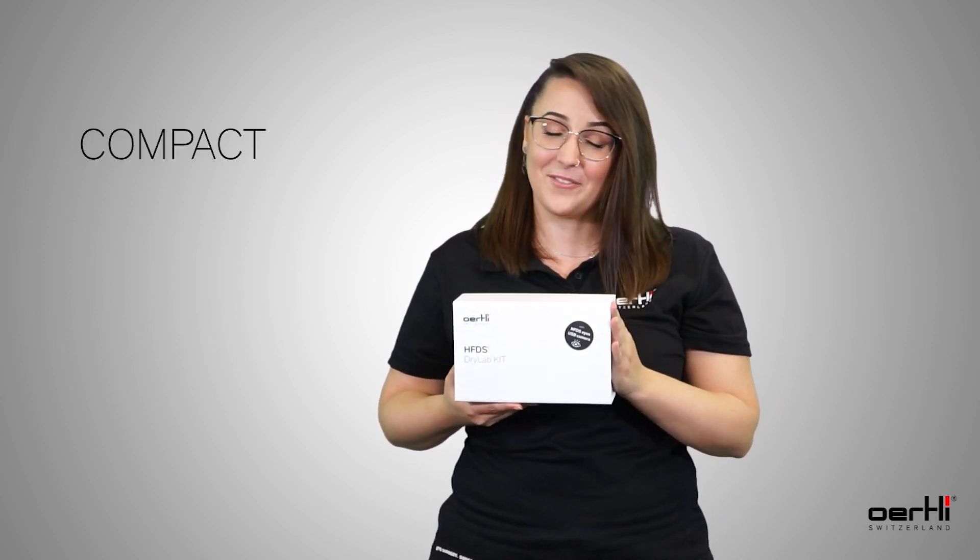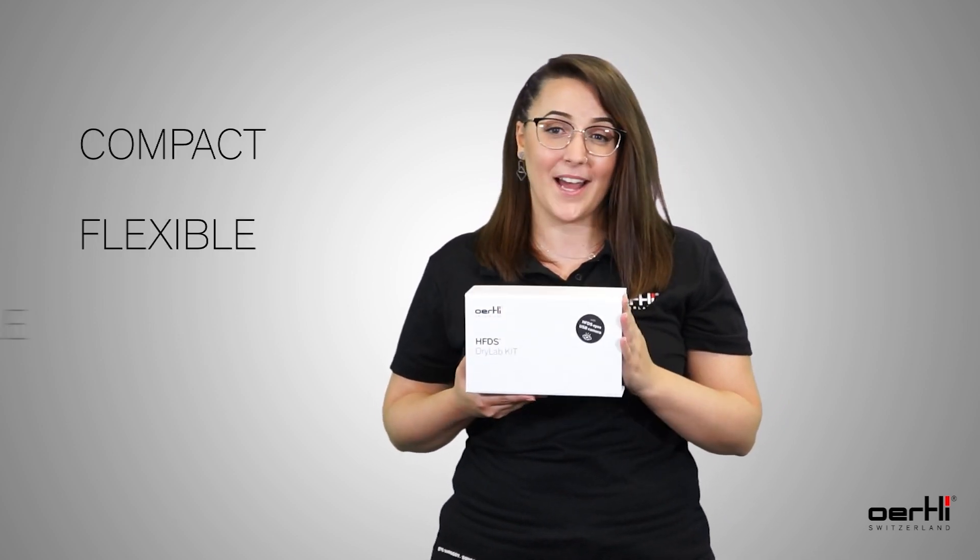Look at this. Compact, flexible and mobile. With this HFDS dry lab kit, it is now possible.